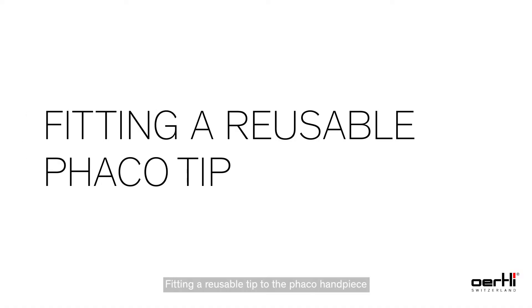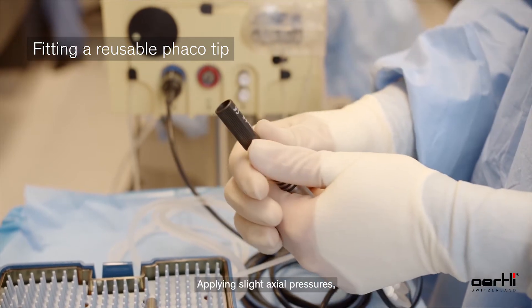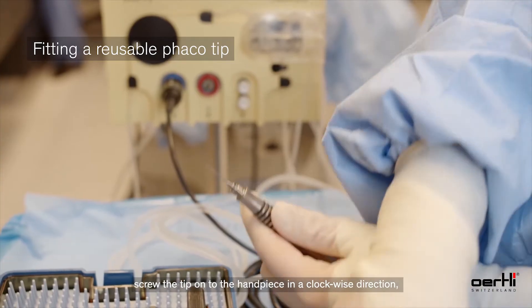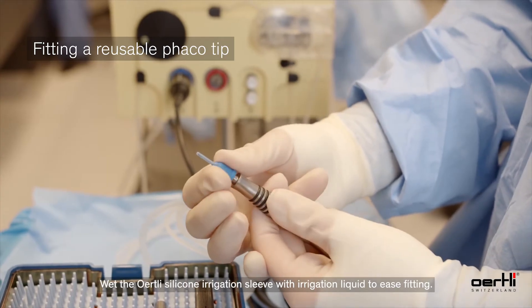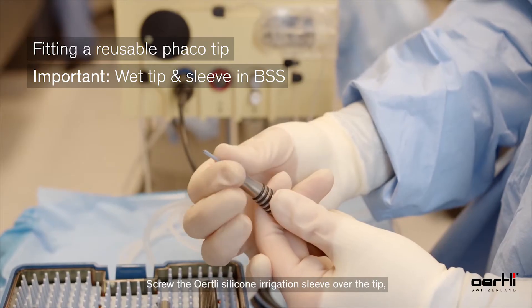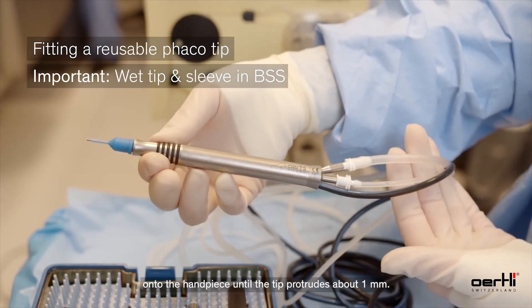When fitting a reusable tip to the FACO handpiece, pull the FACO key supplied over the reusable tip. Applying slight axial pressure, screw the tip onto the FACO handpiece in a clockwise direction until it locks into position. Wet the silicone irrigation sleeve with irrigation liquid to ease fitting, then screw the sleeve over the tip onto the handpiece until the tip protrudes about one millimeter.